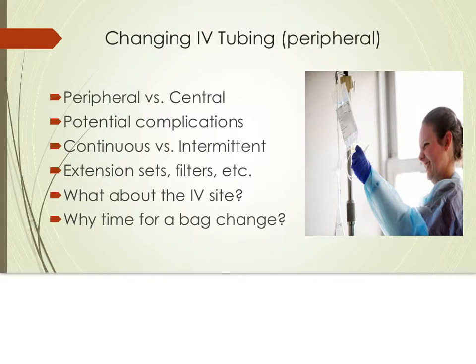If there are any add-ons being used with the tubing, such as a secondary line, extension sets, filters, etc., these add-ons must also be changed every time the tubing is changed. It is best to try to coordinate the tubing change to occur at the time a new bag is being hung so that the new tubing is not inserted into a bag that has been hanging for several hours. No bag should be allowed to hang more than 24 hours.